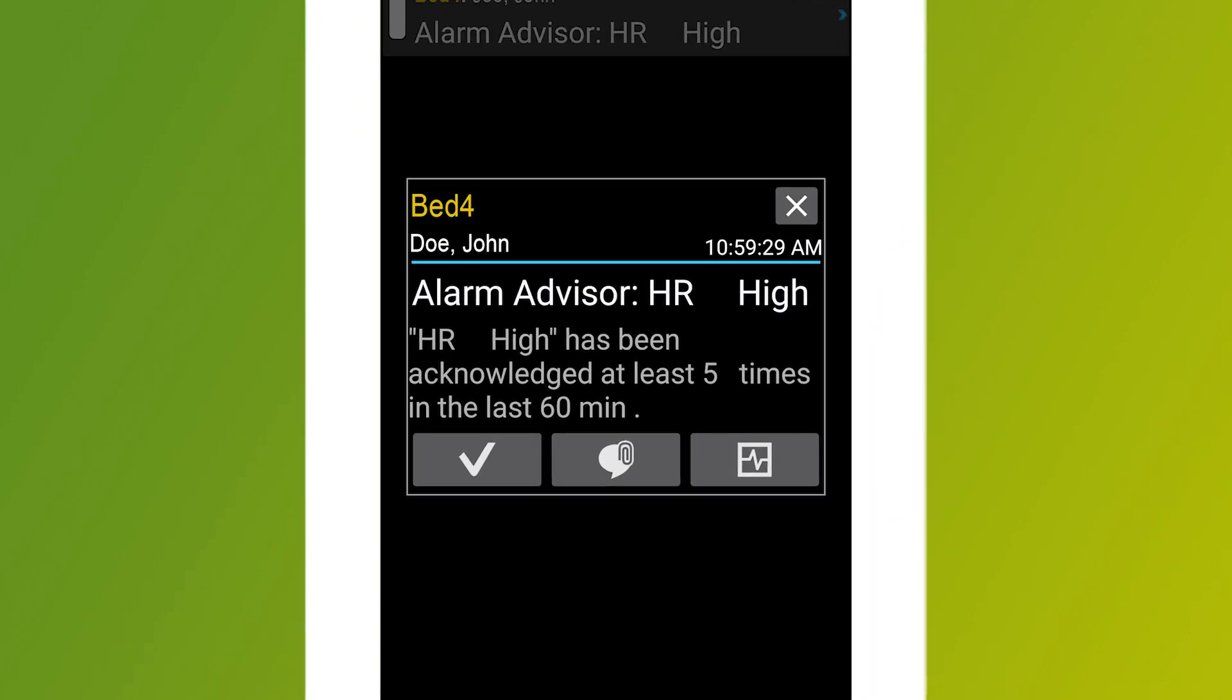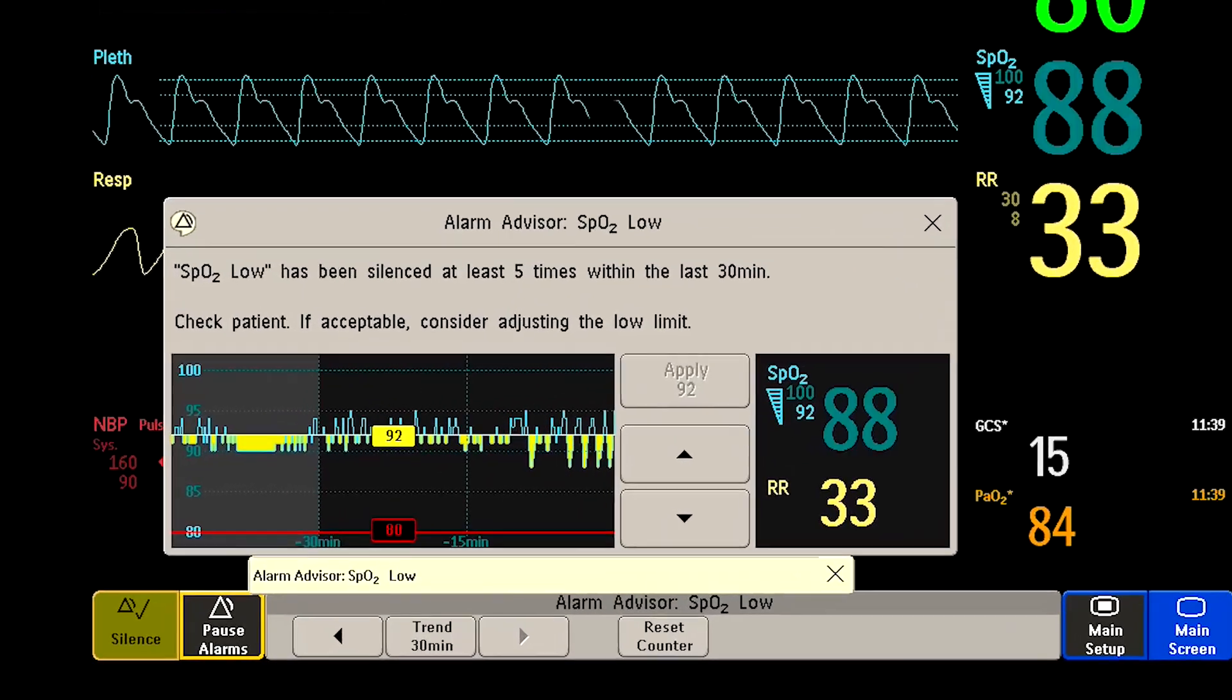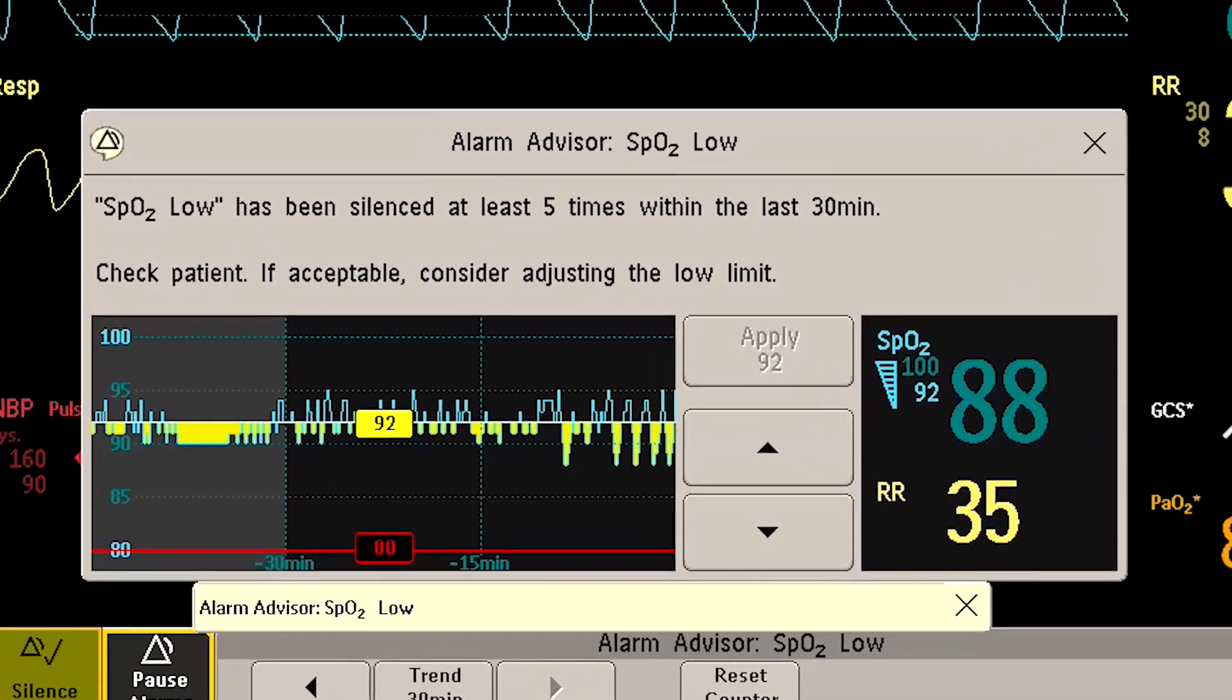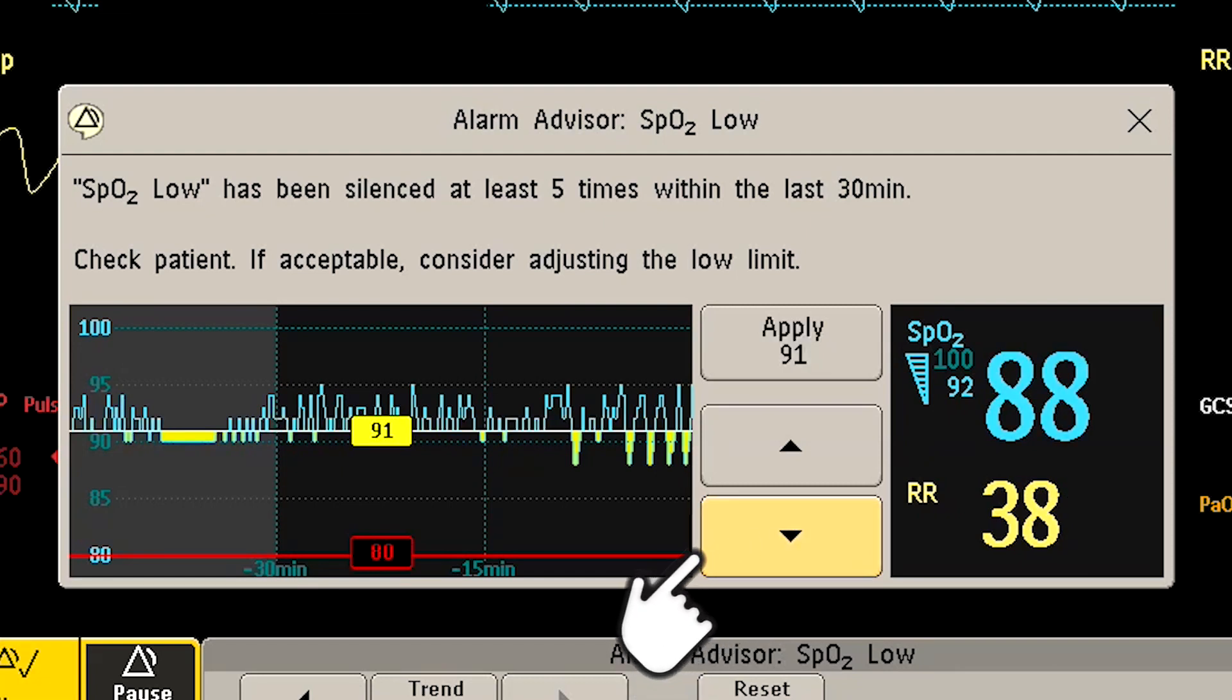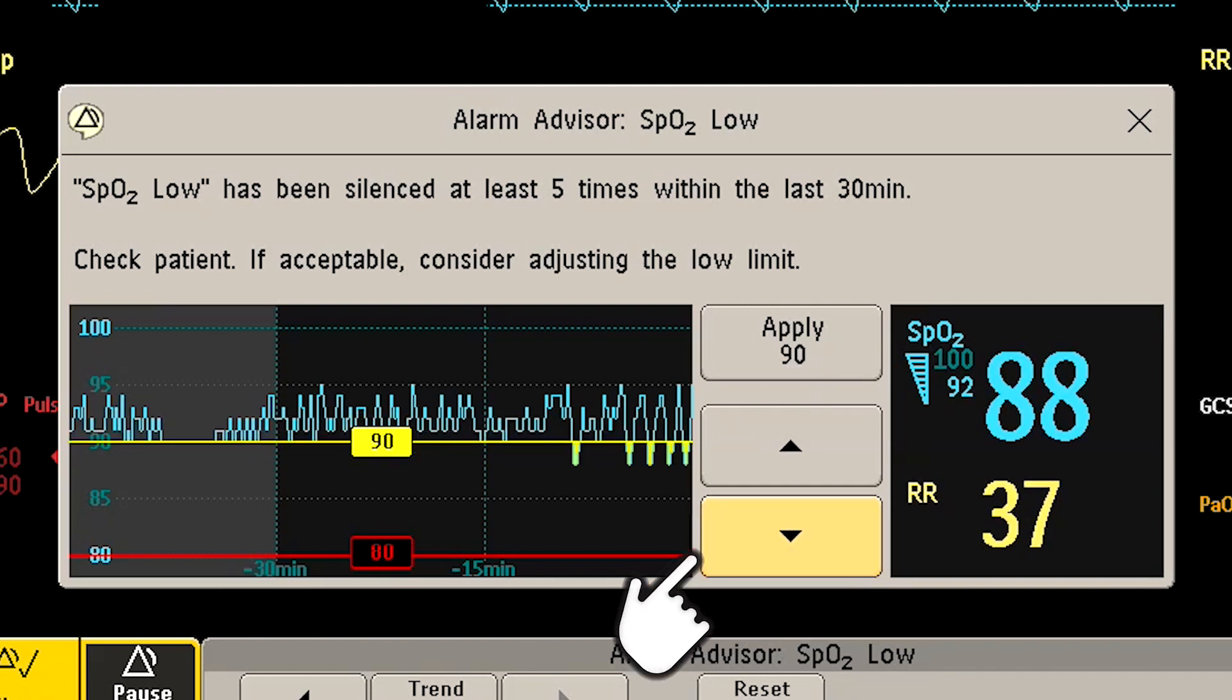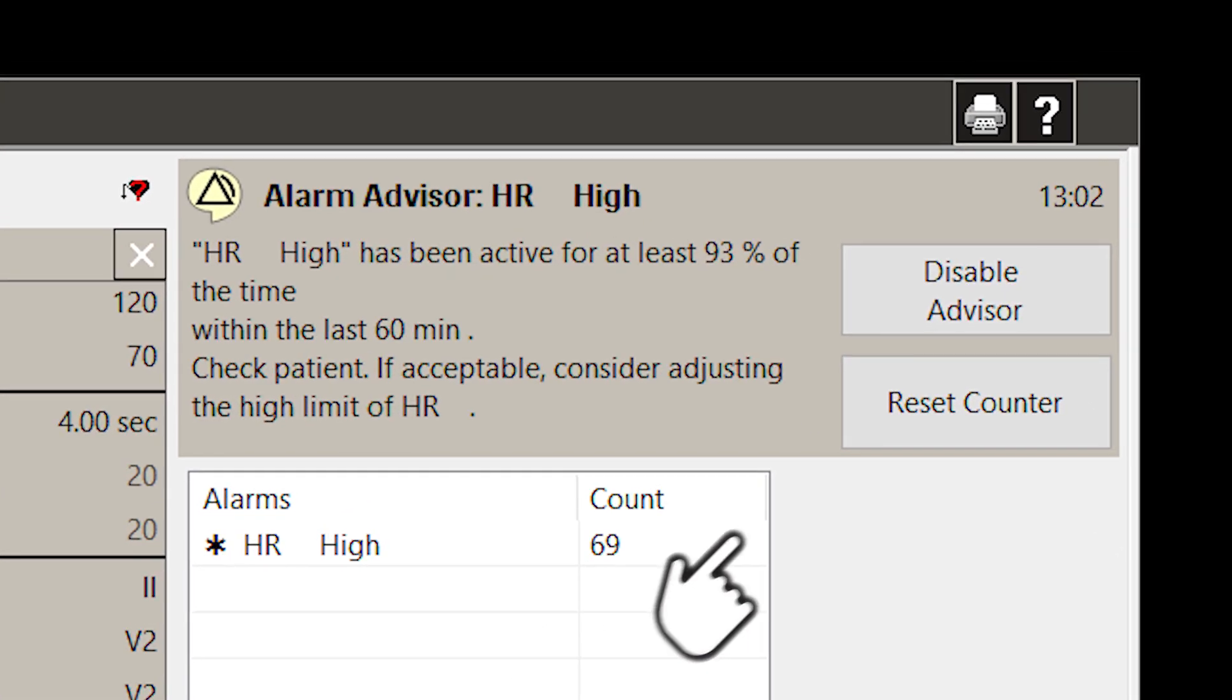This prompts you to evaluate that patient's condition and either take action or personalize their alarm limits. When you need to make an adjustment, the app will display your hospital's customized suggestions on how to tailor settings to that specific patient's needs. You'll be able to adjust those alarms from either the bedside or your PIC-IX.